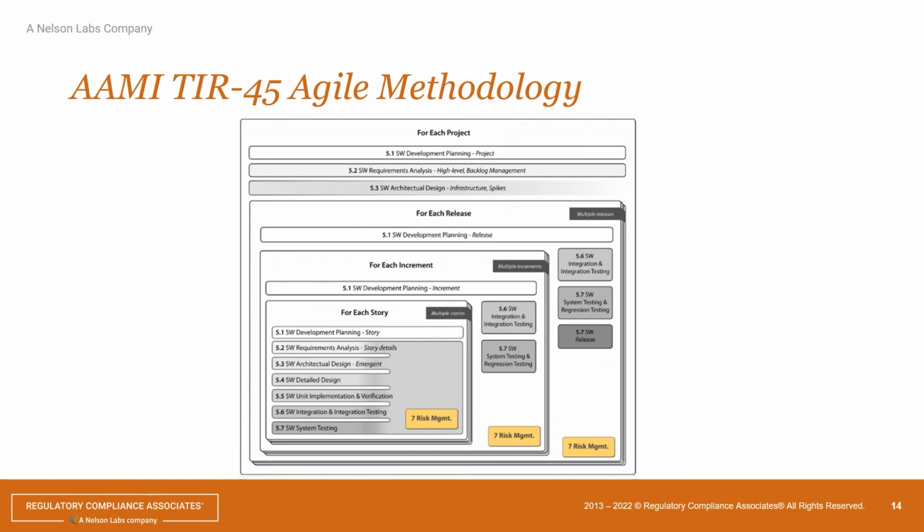But in medical devices, you need to have your documentation, basically your design and development documentation, DHF, and that's your requirements documentation, your architecture and detailed design documentation, and your V&V documentation and traceability across those. And that's why in this model, for example, you could choose that you may do a few sprints and then you release to the client. Maybe the worst case scenario should be that you harden all your documentation before it goes out the door, that you have everything in place before you do that. So that's just a mechanism if you're using Agile development.